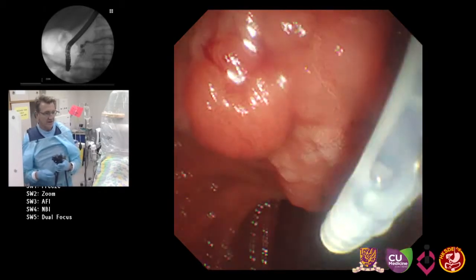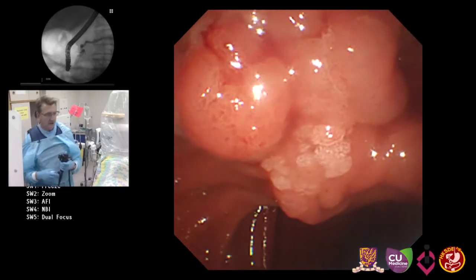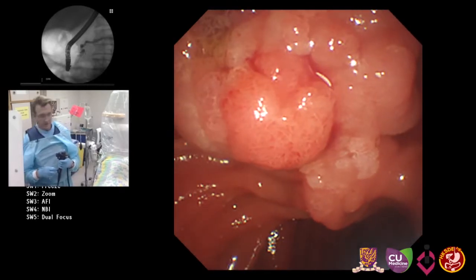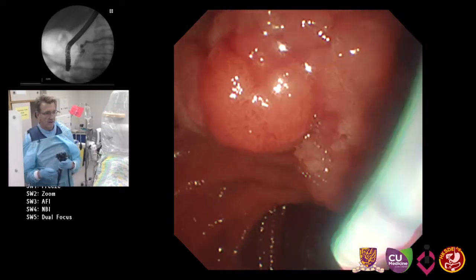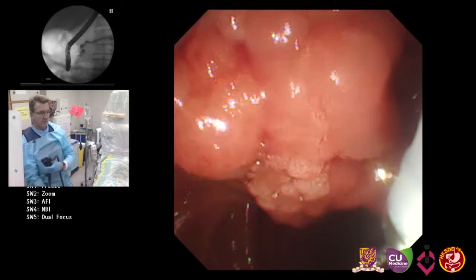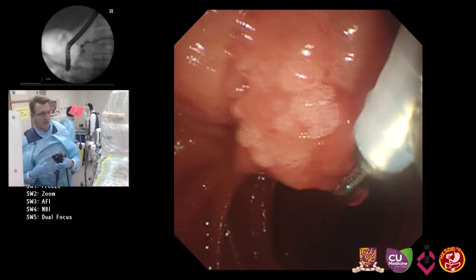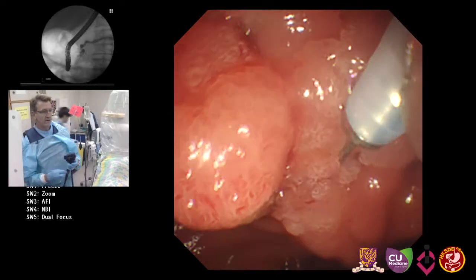But I think the endoscopic assessment, so I have the elevator open and then I ask Morning to put the needle out. Okay, good. And now I lift up, the needle's out. So you must always have the elevator open. We can give some Buscopan or glucagon. Inject a little bit so we make sure there's no air going in. Good. And then we just make an injection here.